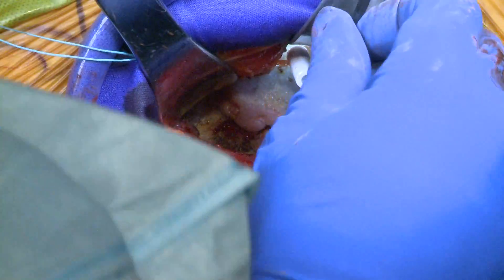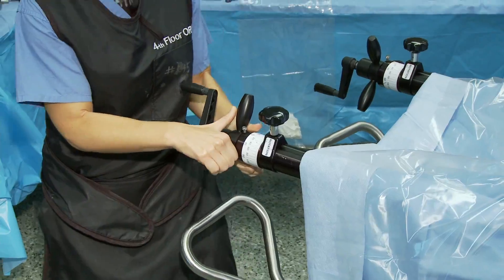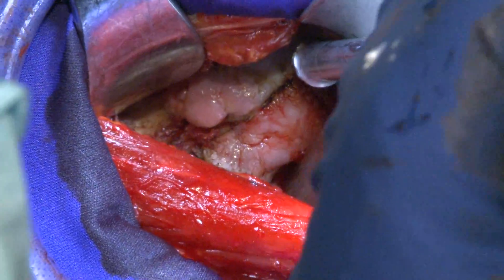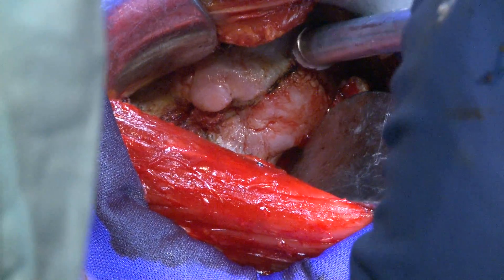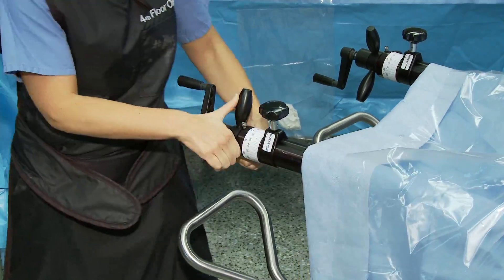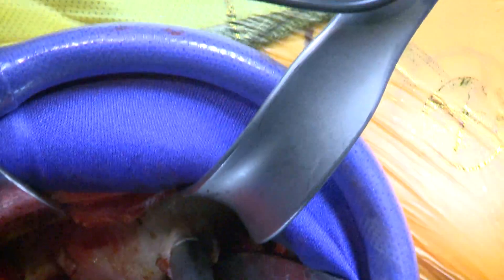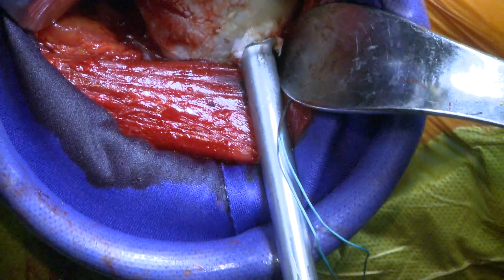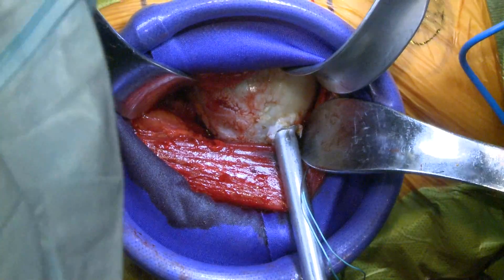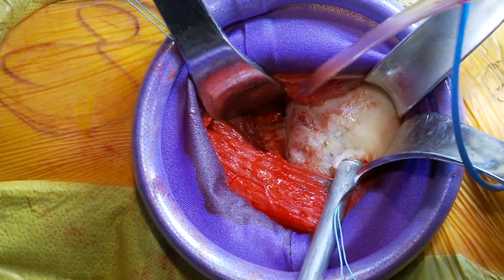Now you can see the head and neck. The assistant is pulling fully out on traction and you can see the head come out a little bit. I like to dislocate the head while it's still attached — it doesn't always work but we're going to try it. She's going to release the external rotation lock and then we should be able to pull the head out. I've just dislocated her head — I like doing it that way because it helps me see a little bit more posteriorly, and I want to see the lesser trochanter.